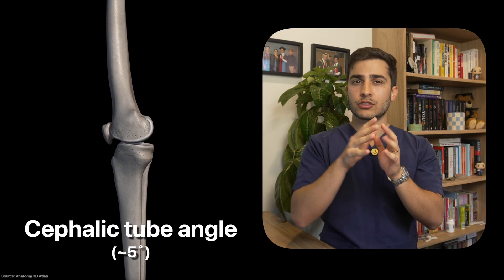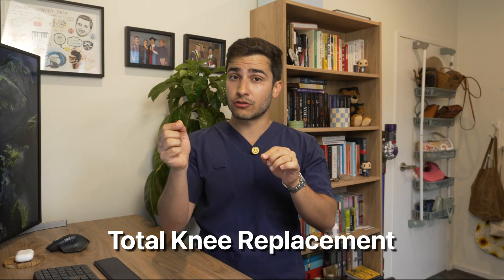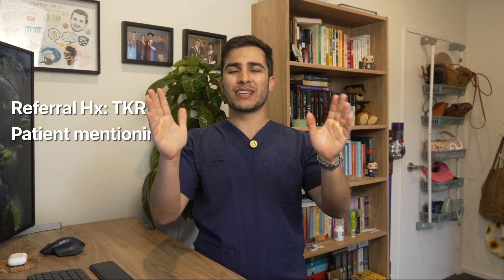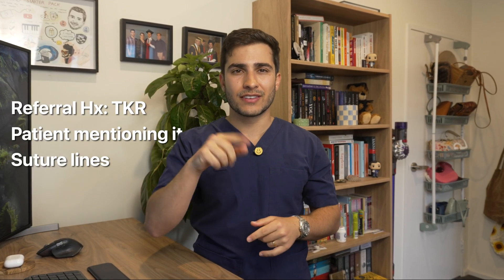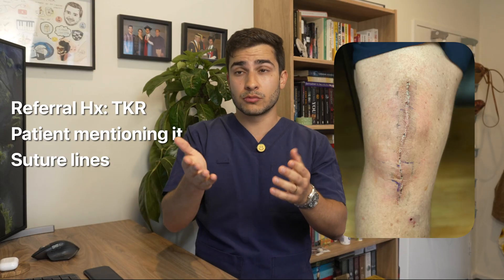And then he said if you want the condyles superimposed top to bottom, you need a tube angle of about 5 degrees towards the patient's head, or cephalic. But take that with a pinch of salt, because that rule only applies when the patient hasn't had a total knee replacement, or TKR for short. As a radiographer you'd easily know this either by the referral, the patient saying it, or just by looking at the knee — because the surgical suture line is visible right in the middle.